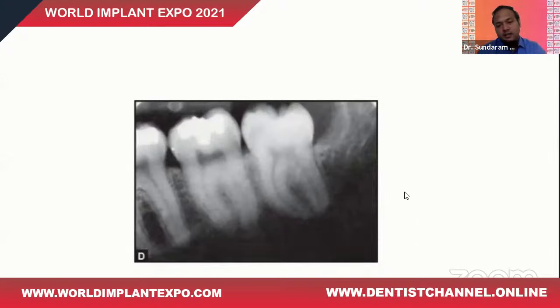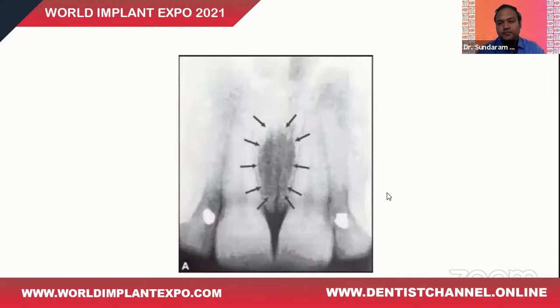Now, this is an intraoral periapical radiograph of the lower molars, where you can see a hazy radiolucent region below this area. You can see the mandibular canal a little bit in this region, but you're not sure whether it is continuing or not, and you see a hazy generalized radiolucent area. This is the submandibular fossa that is seen in intraoral periapical radiographs.